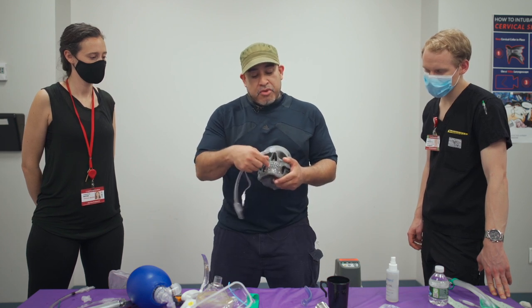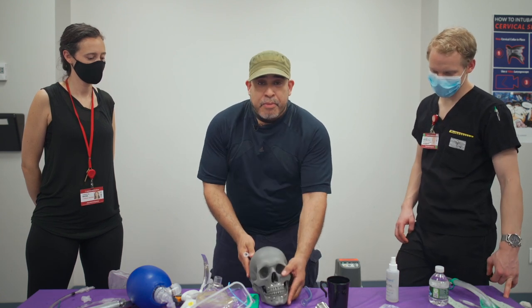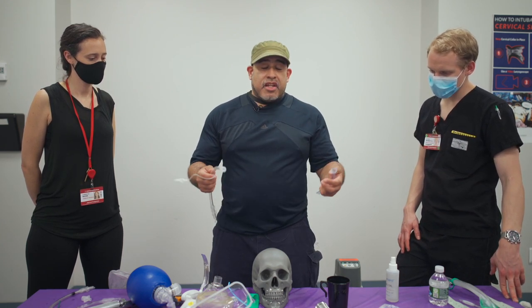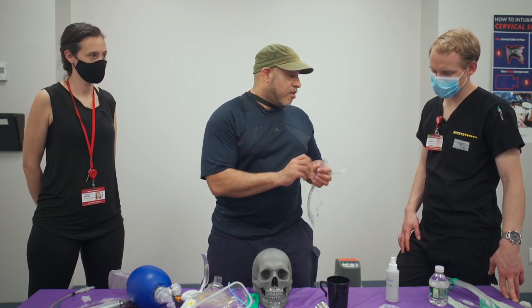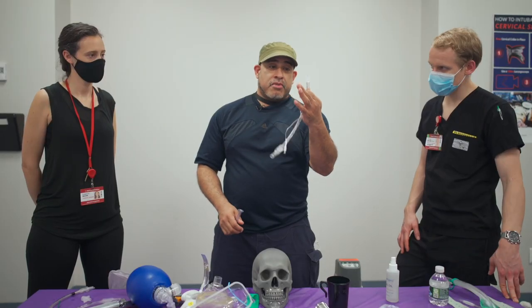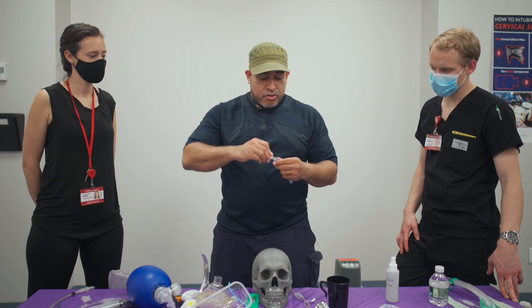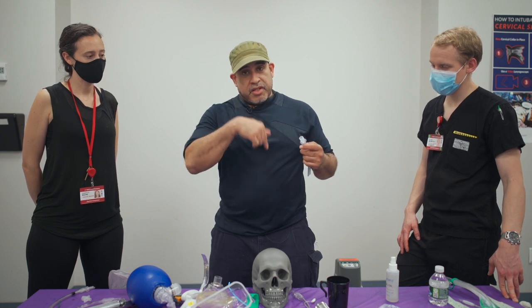If I can't put air through the mouth, and there's naturally a nose here, I can put a device in the nose that I can aerate oxygen through. So when I think of the scenario of trismus where I can't open the mouth, I think of a large enough nasopharyngeal airway. It goes from my nose down to the back, to the angle of my jaw. And I think of an 8.0 ET tube. Why an 8.0 ET tube? Because it's wide, and this connector is tight. It will be tightly fitted through the nasopharyngeal airway, and if I can do this, I can possibly oxygenate this patient.